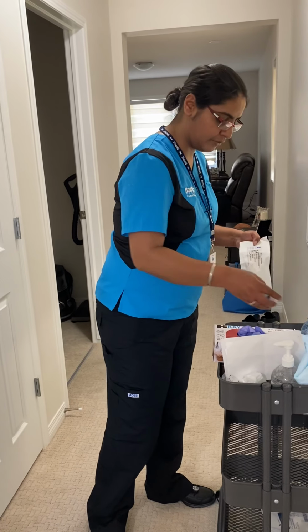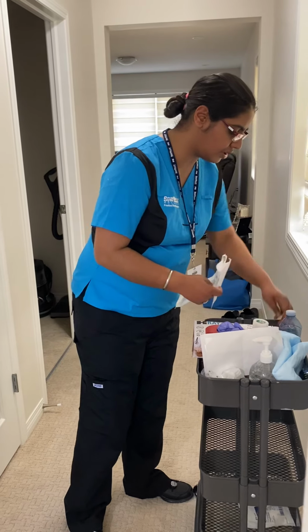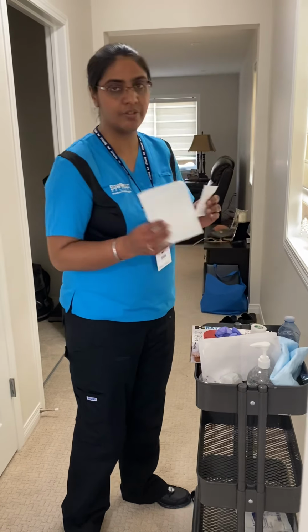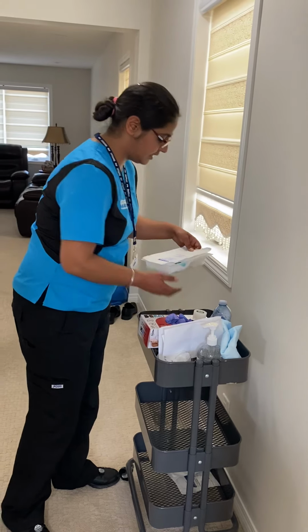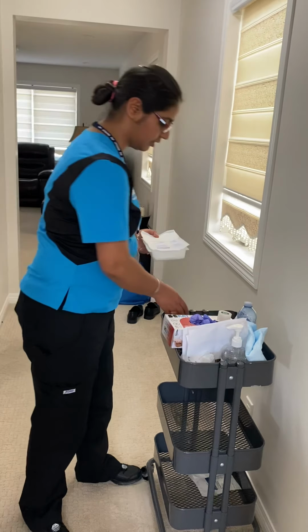And my tape for closing the wound, and I have some extra gauze, 4x4 and 2x2, in case of any extra drainage or blood. And my dressing tray. This is intact, not ripped. It has no expiry because it comes in a bundle.